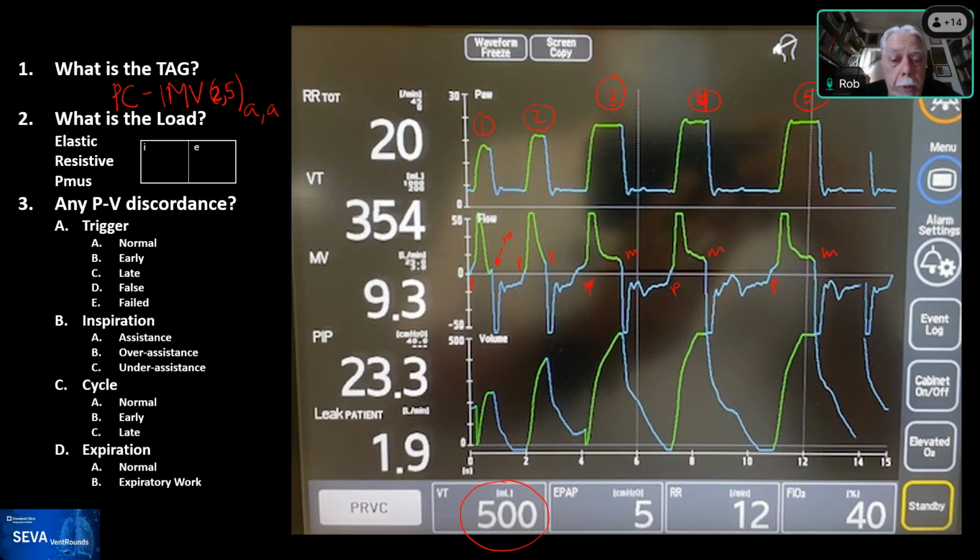When there is no pressure support ventilation or spontaneous breathing within the set time, mandatory ventilation is performed. So that clearly indicates that you have both spontaneous and mandatory breaths, and that's why it's IMV type 2. Now, the manual could be clear and say that the spontaneous breaths suppress the mandatory breaths, but manufacturers don't recognize that at this point. I have no doubt that it's IMV type 2.